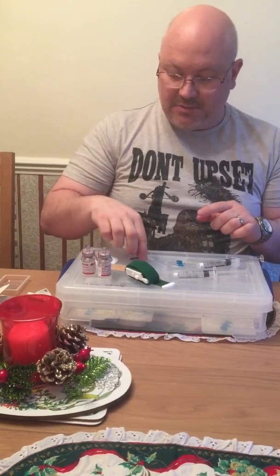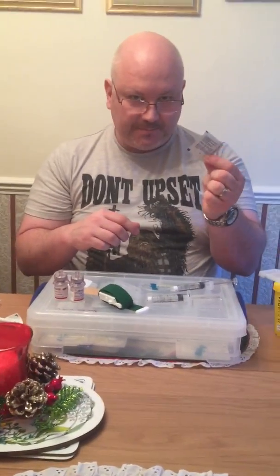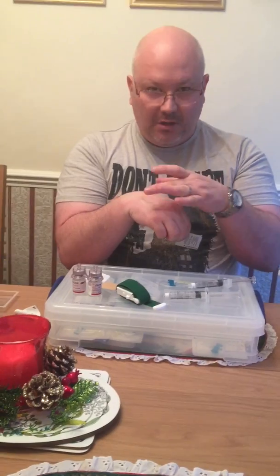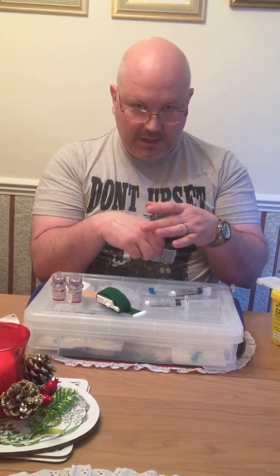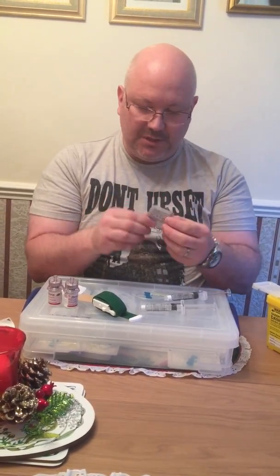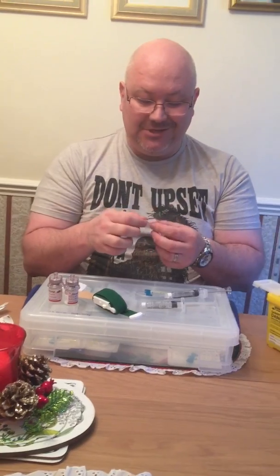What I need to do now is prepare my hand. I've already swabbed this. If you use these isopropanol swabs, you should leave it about five minutes before you put the needle in, because the alcohol doesn't kill any germs straight away — it dehydrates them. It takes about five minutes to kill them. I've already pre-swabbed, but I'm just going to do it one more time to show how to do it.